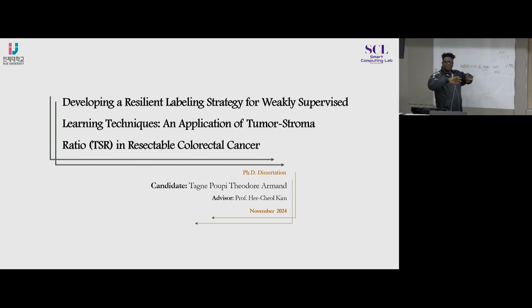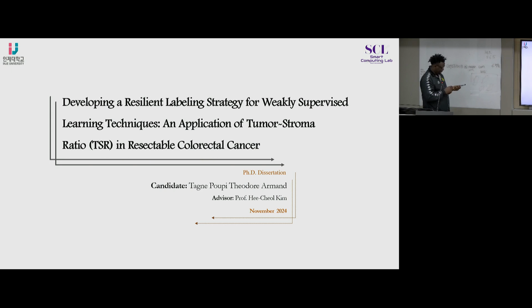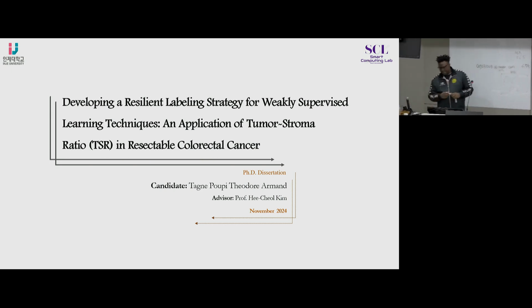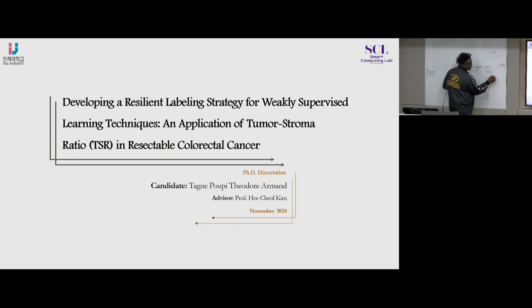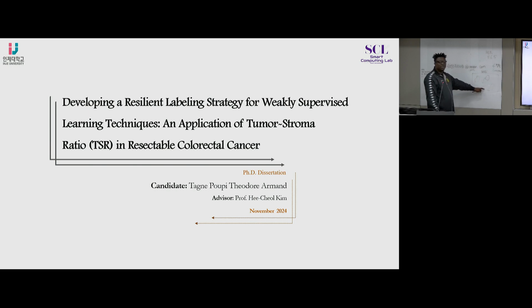So it's making the slides very distant. So we have to be careful when we are assigning a label at this point. For example, when we started our project, it used to happen like this. You have these slides, and then the pathologist will come here and write this and give a class. It can be necrosis, for example. There are many cancer classes, so he can give a class here. Once he gives the class, then you have to train using it.